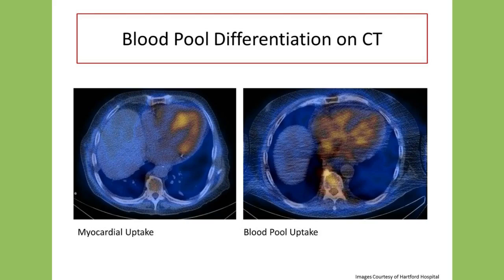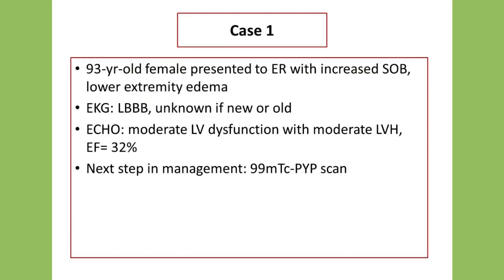So ensuring that we're allowing for adequate time for the blood pool to clear, and also having that SPECT information and SPECT CT information, if possible, really helps with a definitive diagnosis in these particular patients where it is not very clear or it's a little confusing.